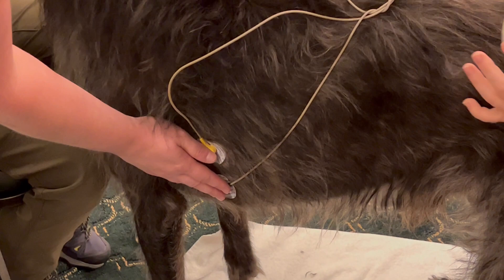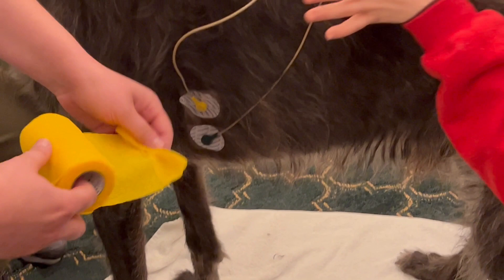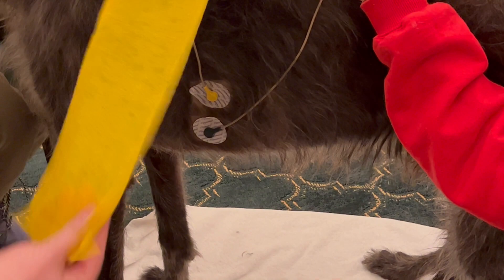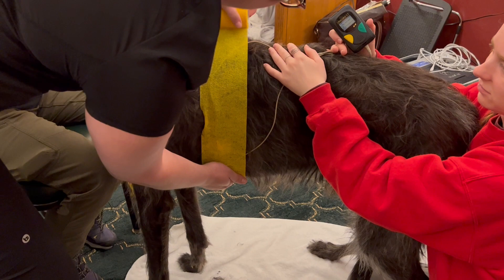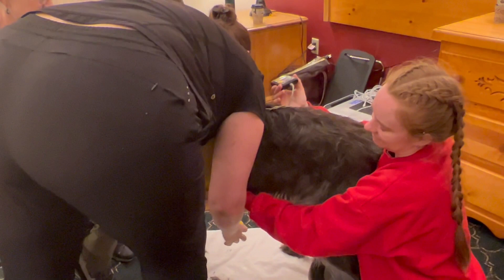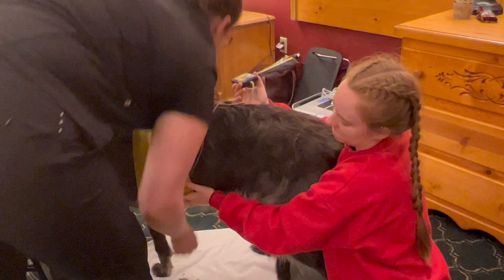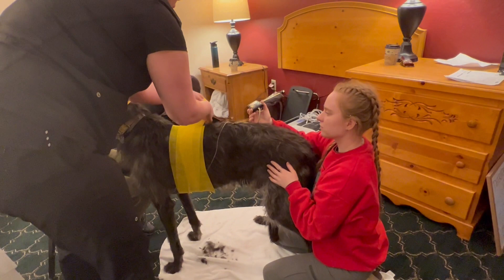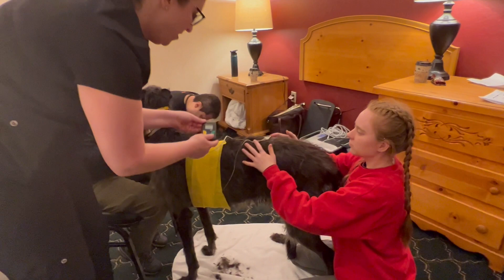We will put a layer of vet wrap around these to make sure that they stick. Vet wrap — Elasticon's a little bit rough, but it can also be a little bit harder on the skin. What we're going to do is just wrap this around right here. We don't want this to be too tight, just want it to make contact with the pads, so we want him to be comfortable and not feel like he has an 18th century corset on. It sticks to itself but not to the fur, which is nice.